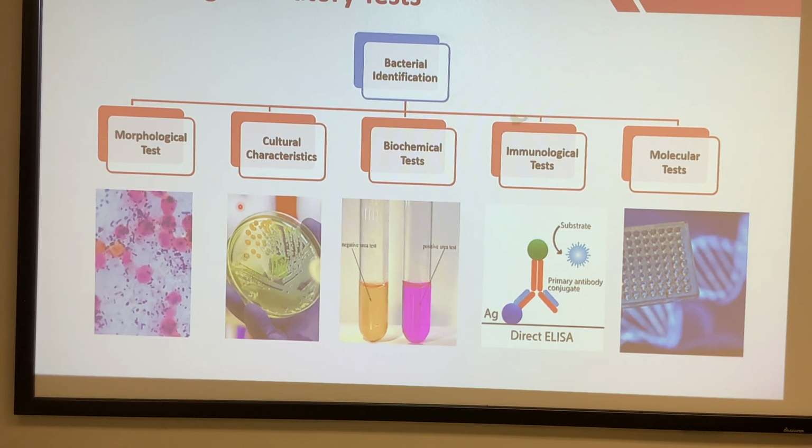And the old microbiology labs do a lot of biochemical tests. That includes the indole test, urease test, catalase test, you can name it, going on and on.